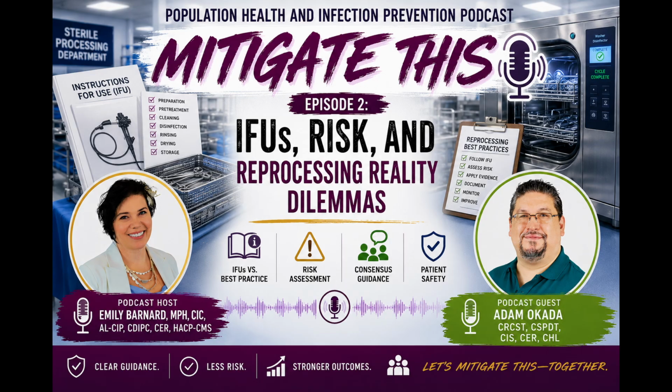So that's where you're opening yourself up. Not that there's a massive difference between those two things, but according to the IFU, you're doing one wrong. So I think that's something that is really important for people to remember, is that those instructions are very specific for a reason, and that it's really important that we follow them. Yes, it's difficult. I would say almost impossible to memorize, but you still have to try to do it.